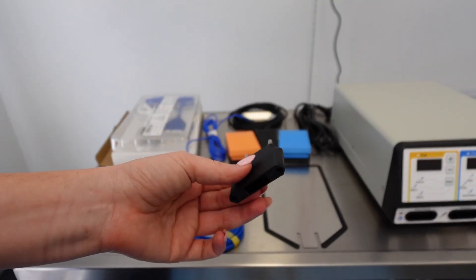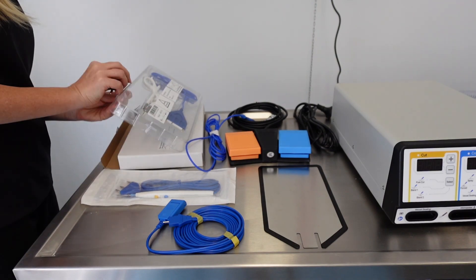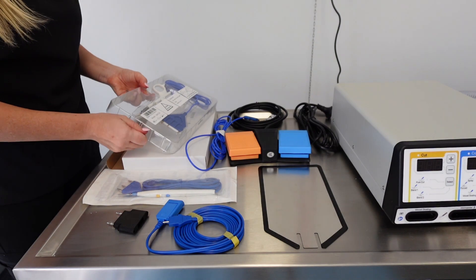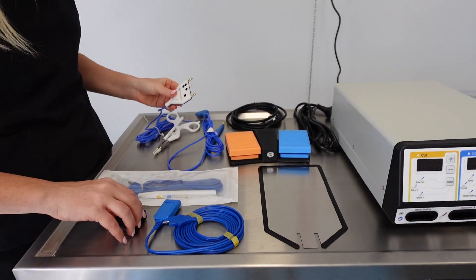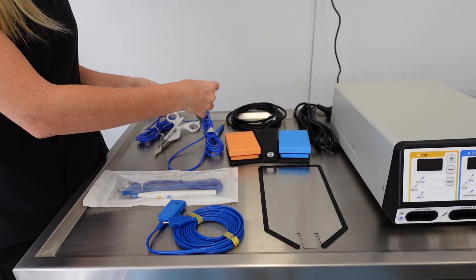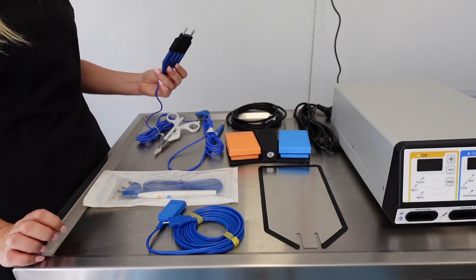This is the adapter we're going to use to attach the vessel sealing component. Opening up the vessel sealing attachment, we attach the end of this accessory to this adapter, and then we'll attach that into the front of the unit when we're all set up. It just fits on like that.